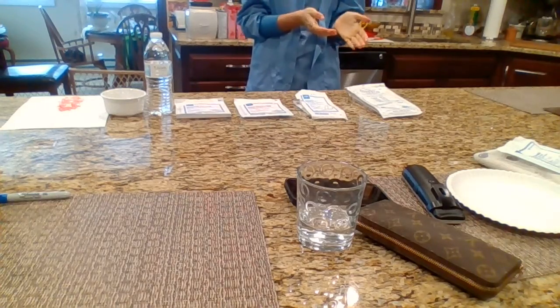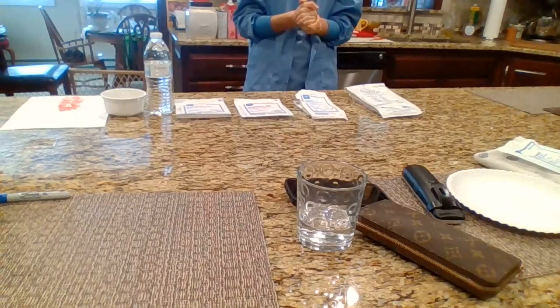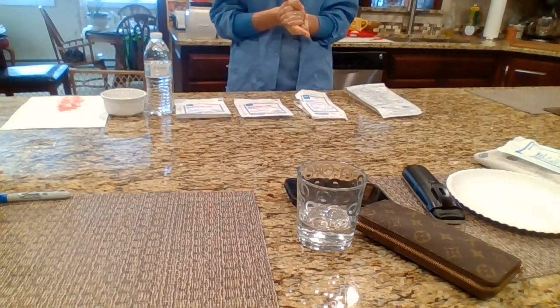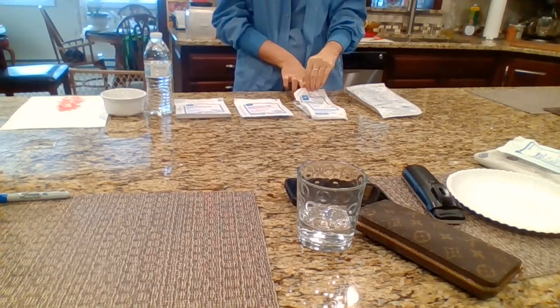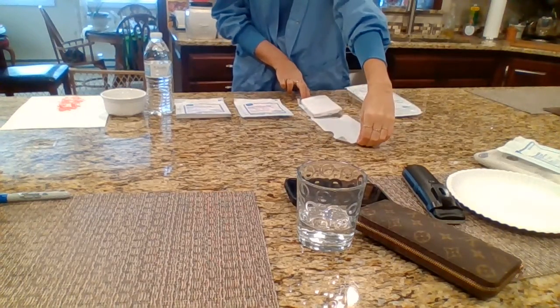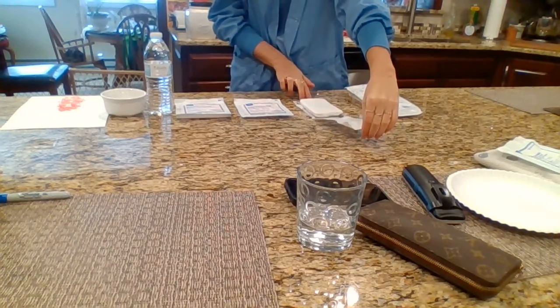So over here I have my sterile gloves. These are the last thing I'm going to be opening up and touching. So over here, second furthest away, I have my ABD pad, so I'm just going to open up, do the ballerina arm thing, and get that all set up.